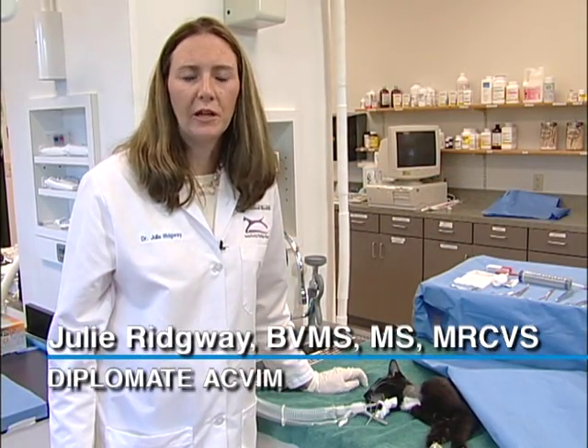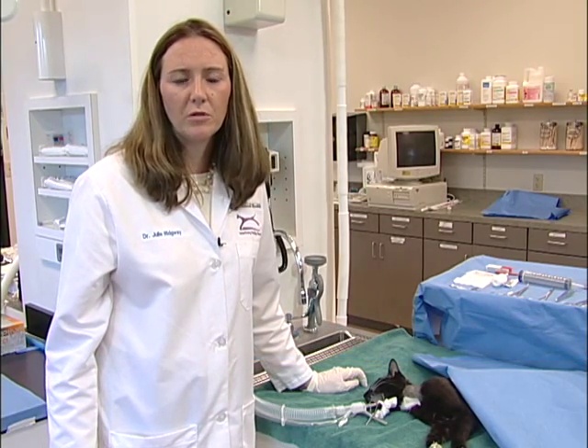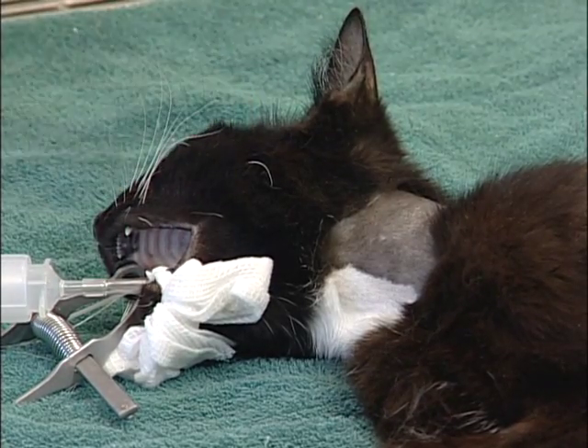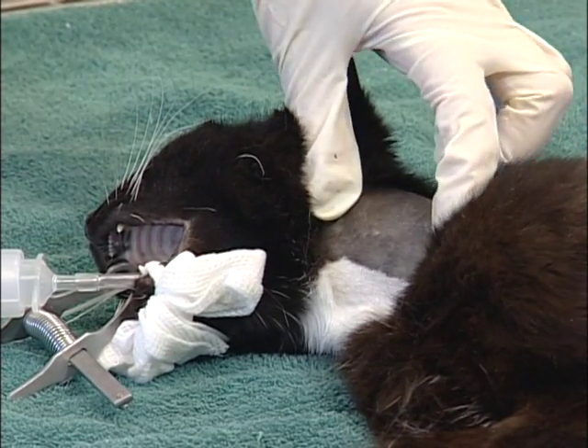There are numerous indications for feeding tube placement in small animal practice. One of the easiest, most simple, and most cost effective feeding tubes is the esophagostomy tube. Patients need to be under general anaesthesia for this procedure. The patient should be placed in right lateral recumbency and the area over the mid-esophagus clipped and sterily prepared.